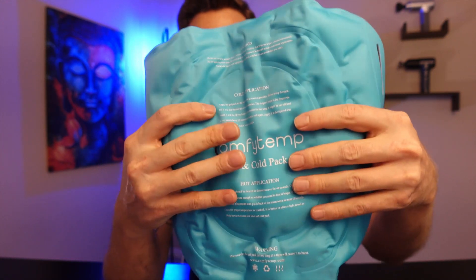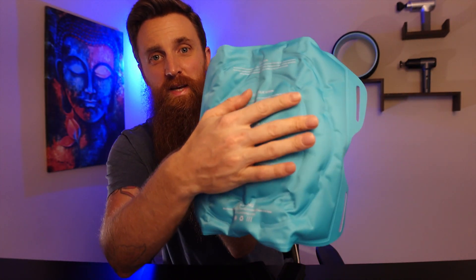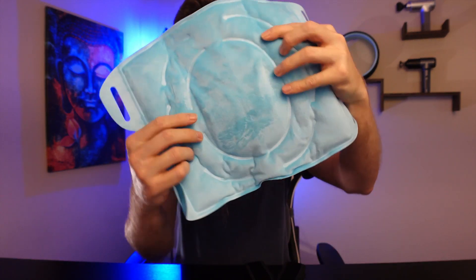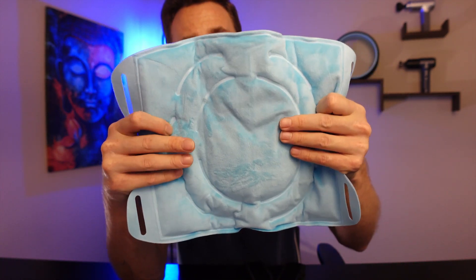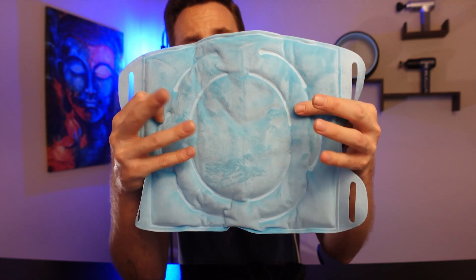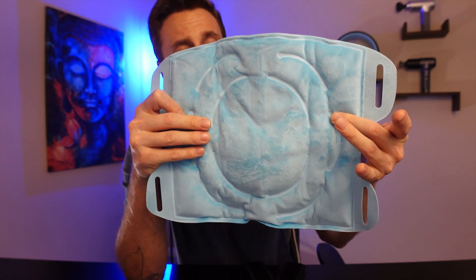With this ice pack it does have two different sides. There is a silky nylon side — this side is probably going to get a lot colder, and it's going to have a lot more heat on it too. Then on the other side you have a soft side, which is going to be a little bit milder as far as the coldness or the heat. There are two different options, and I kind of like that.